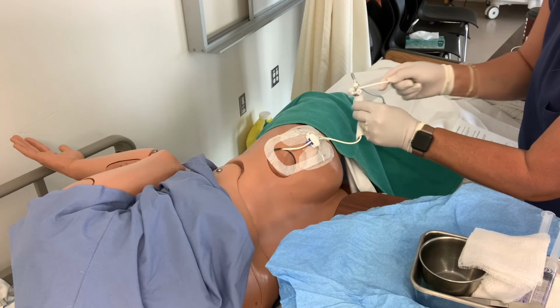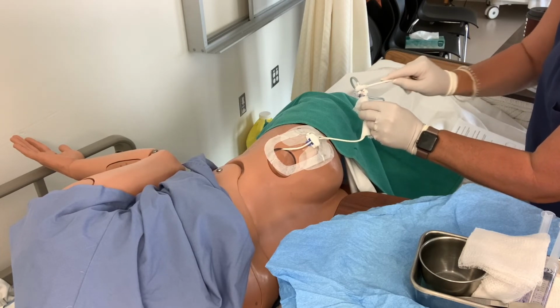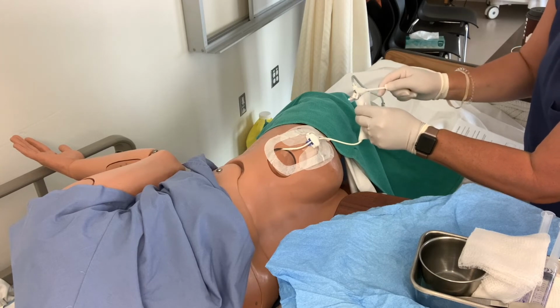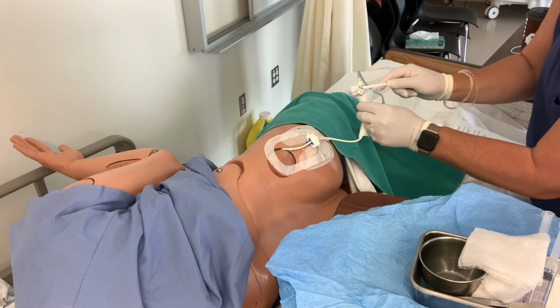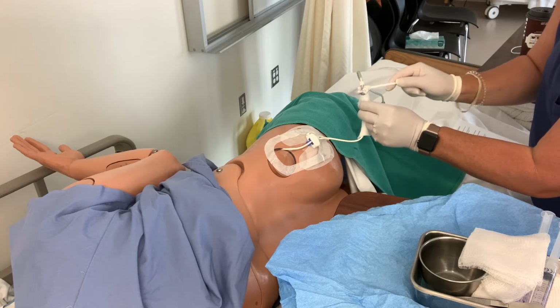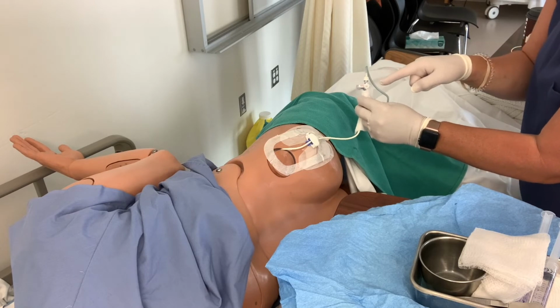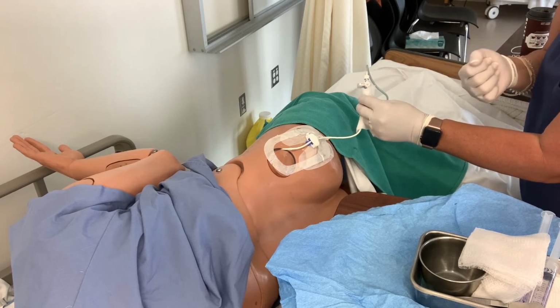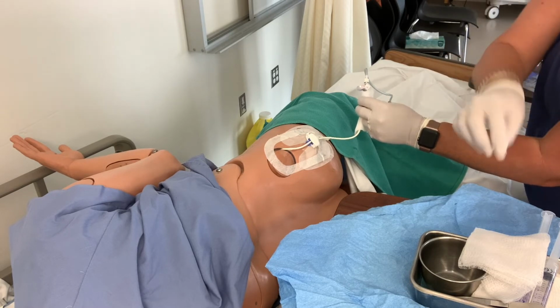So some people feel that with the gauze they can get in and get a better clean on this than they can with the stick. So you're going to see variations in practice here, and I think both are safe. That has been cleansed. With chlorhexidine, you know it needs to have the time to dry. So I'm going to wait a second for that to dry.